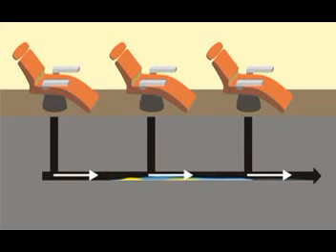Basically, just because you suck up X amount of liquid, that does not mean you will get that same amount of liquid into the collection tank. Some of it will get there, some of it will lay in the trunk line, eventually getting there but letting the solids separate out. A certain amount of it stays in the trunk line and just gets washed through as more liquid comes in.